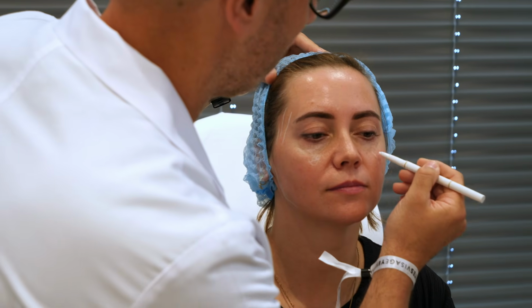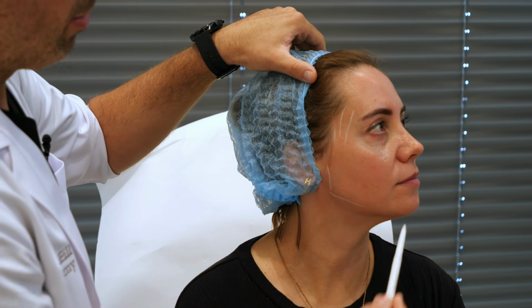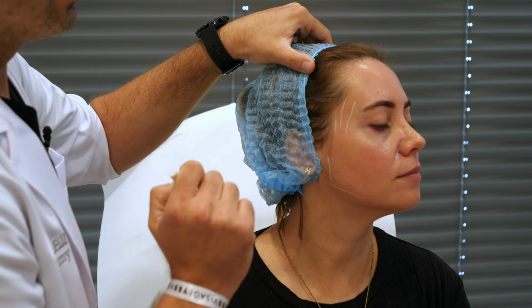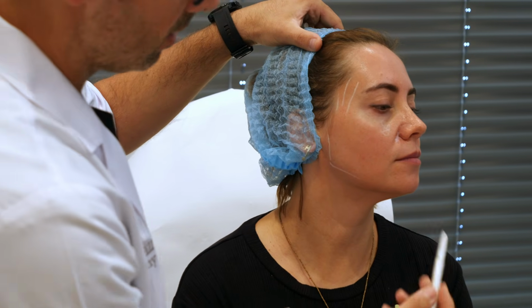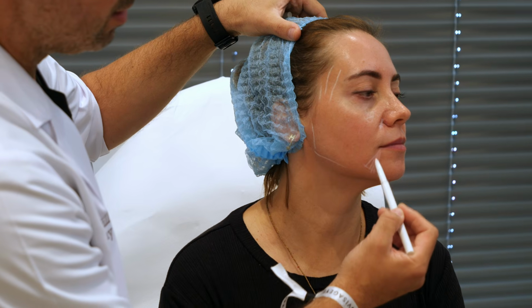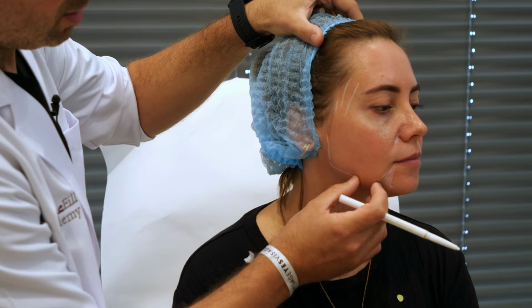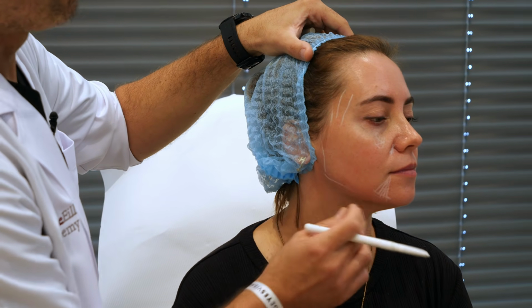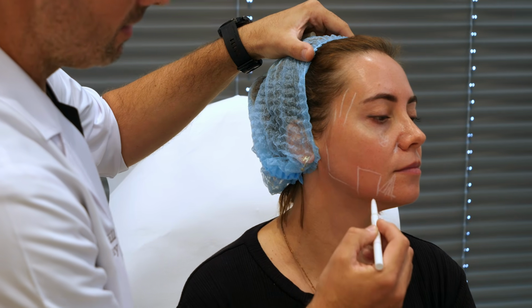And another tip from here. In the lateral plane, the piriform fossa is another zone to think about for our treatment. And at last, the mentalis depression, okay? She is a young woman, and her jaw is smaller, but this zone is heavier.